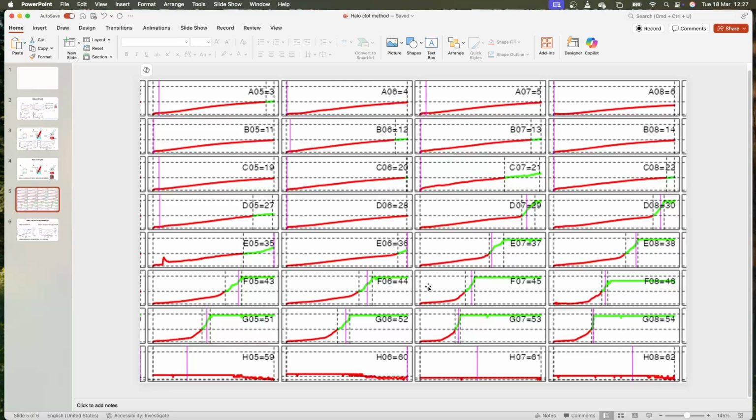We have also used a variation of the assay using clots made from plasma, with added fluorescently labeled fibrinogen. In this way, we could investigate clots without any cellular components in the same setup as the whole blood halo assay method.